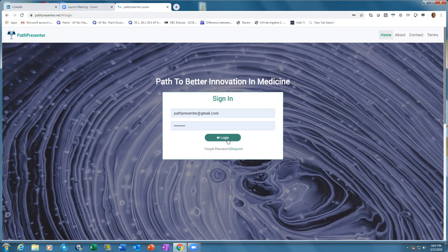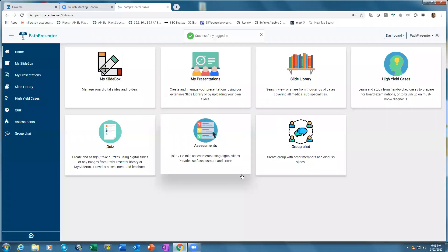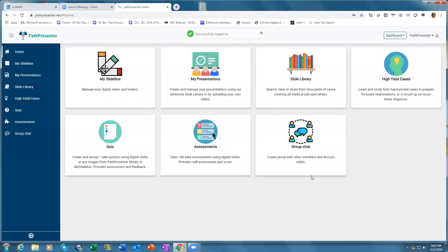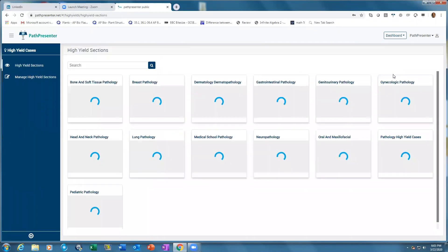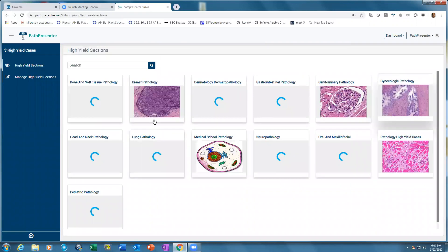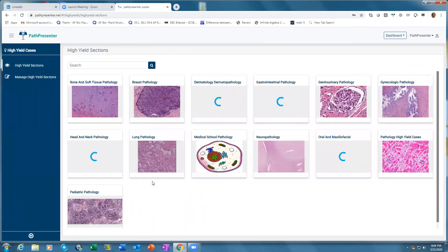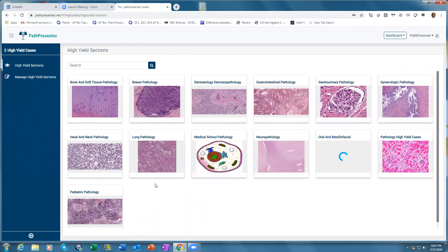You can log in either at home or within the department, then click on the High Yield cases. These high yield cases have been built by very well-known pathologists from around the world.